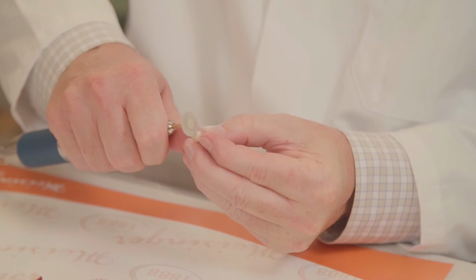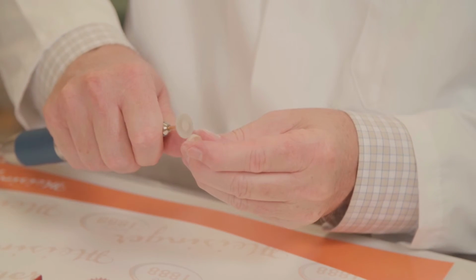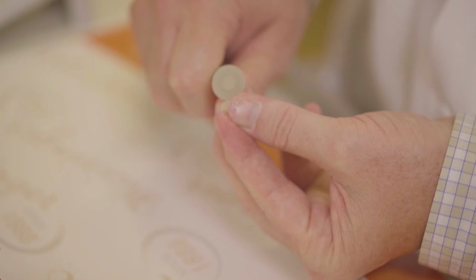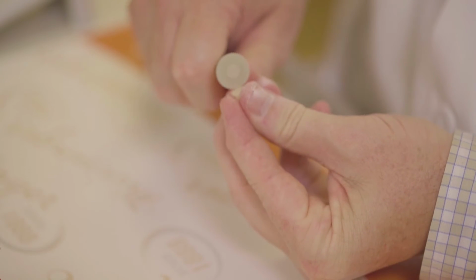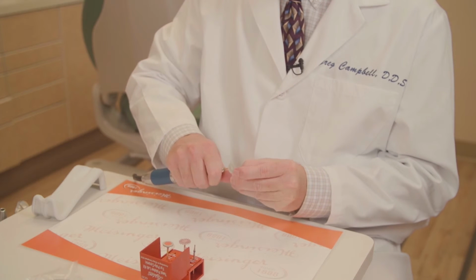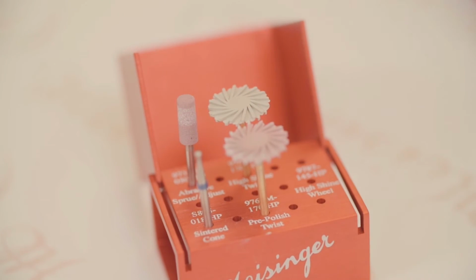So I'm going through my occlusal surface here. I'm going to do my interproximal now. Very light pressure. We get a very, very nice polish. And believe it or not, in a few minutes we are done and we have a restoration that's ready to be characterized or cemented.